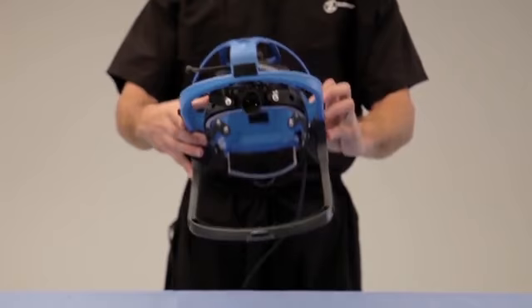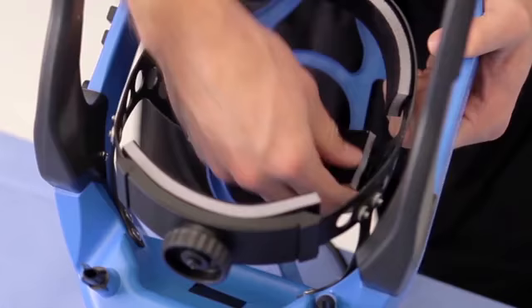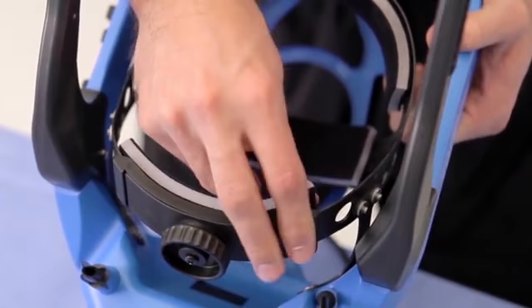Prior to donning the helmet, wear a surgical head covering. First, insert or adjust the memory foam pads inside the helmet as necessary. Use the hook and loop dots to secure the foam pads to the headband.